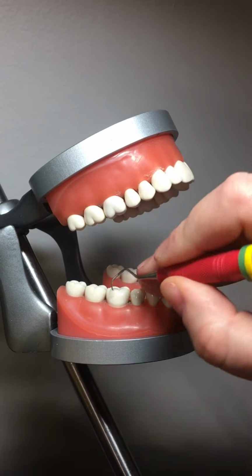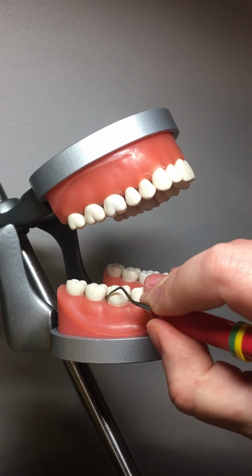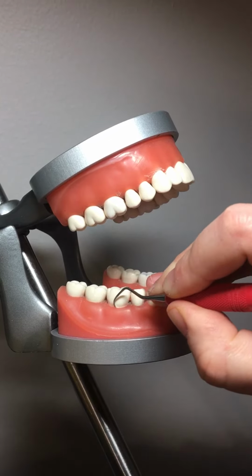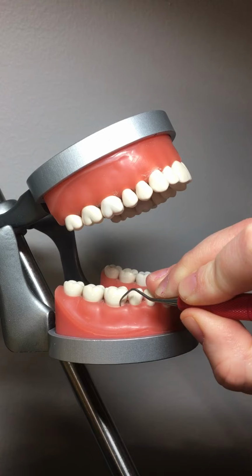And then we often use the horizontal stroke. For the horizontal stroke, you're going to go tip towards the sulcus, and you're going to move horizontally against the tooth, short biting stroke. Tip down, coming across the tooth in short biting strokes.